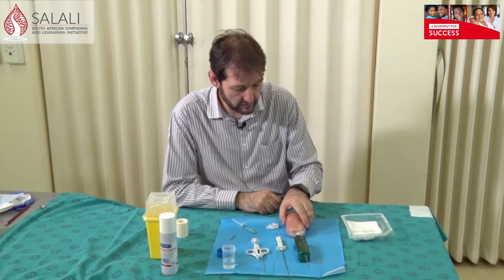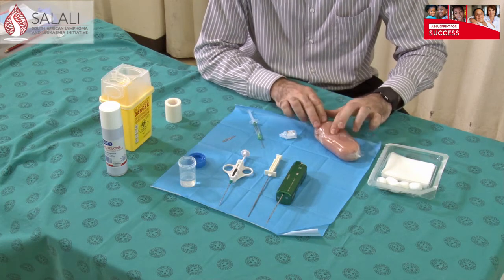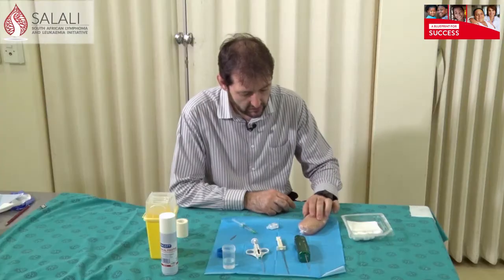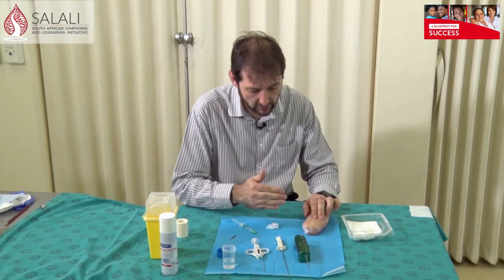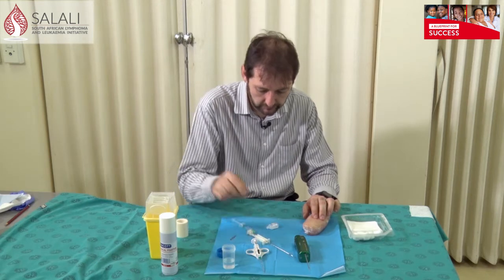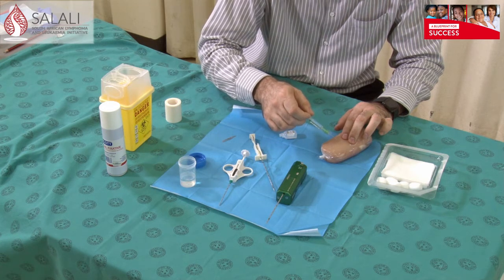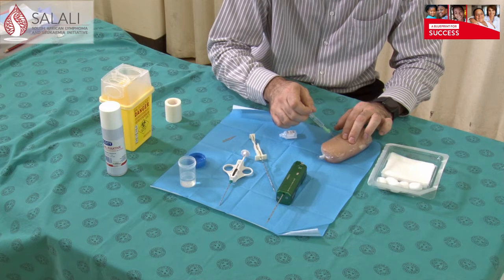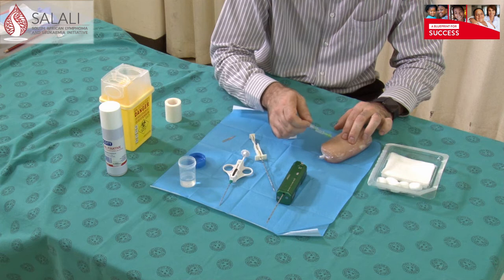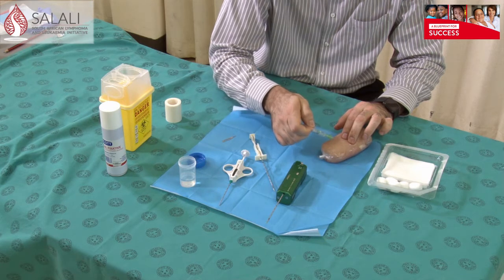I've got some chicken fillets here with olives in that we're going to use as a model. First of all, try and find your lump between your fingers, then work out from which direction you're going to approach for your biopsy. Starting with the manual needle: first, put some local anesthetic into the skin. I would suggest you do this very slowly — the slower you distend the tissue, the less painful it is for the patient.